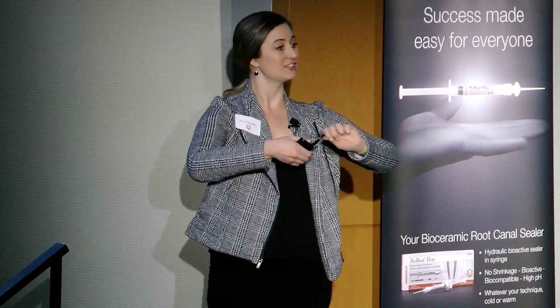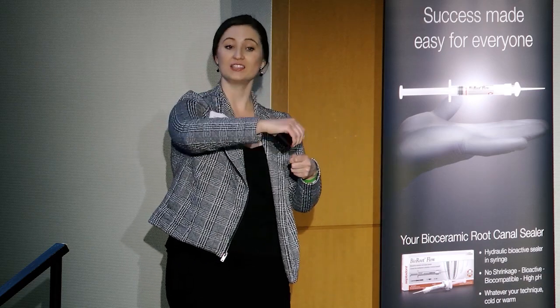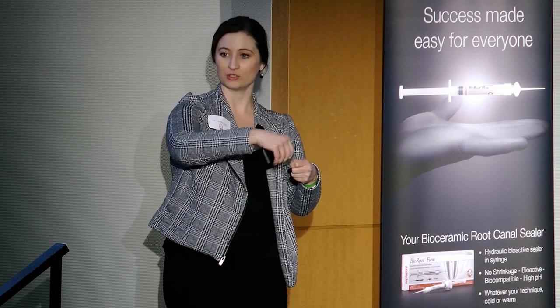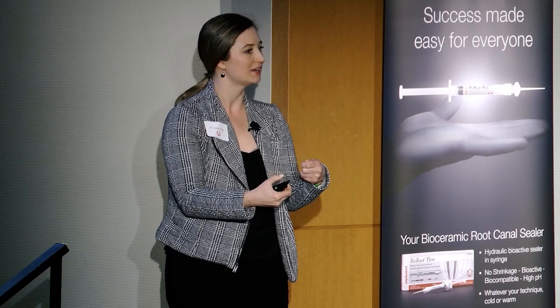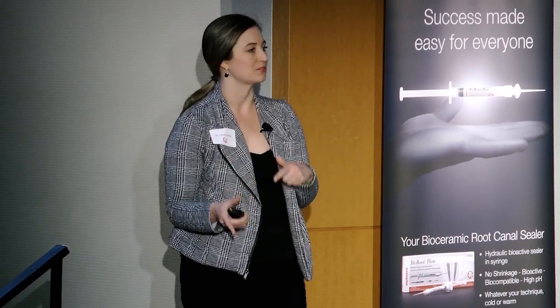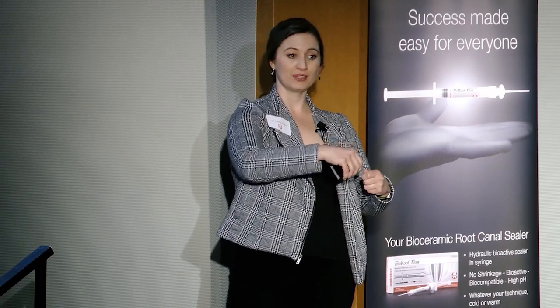And then after I inject the product in the canals, I take the tip off, the Luer lock tip, and I dip my gutta percha into the hub to be able to use sealer from there so that I don't have to extrude more onto a mixing pad, and I'm able to reduce waste and minimize cost. So using what's in the hub of the Luer lock tip, I take my gutta percha, and then I place it. So I maximize the amount of sealer in the canals.